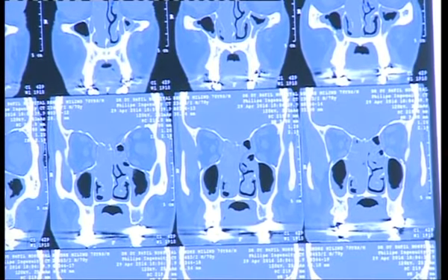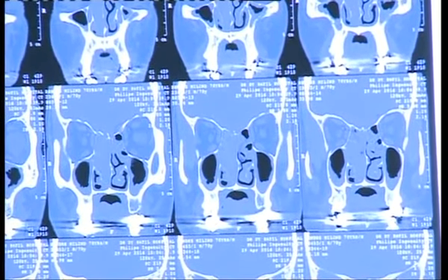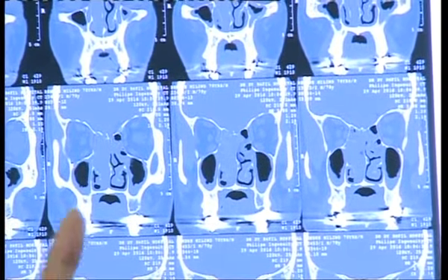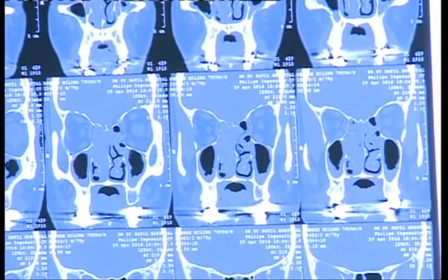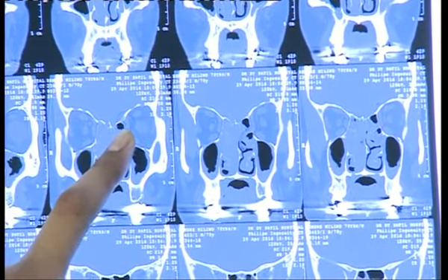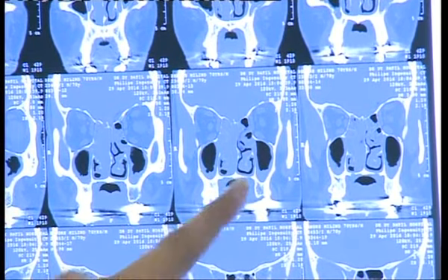Many a time you don't find the artery that way. And the best way, believe me, because the anterior ethmoidal roof pneumatization is variable, but this relationship is always fixed. The moment you find the middle turbinate ground lamella and you see the attachment up onto the skull base, the anterior ethmoidal artery is immediately anterior to it, within a few millimeters of the upper attachment of the basal lamella onto the skull base.